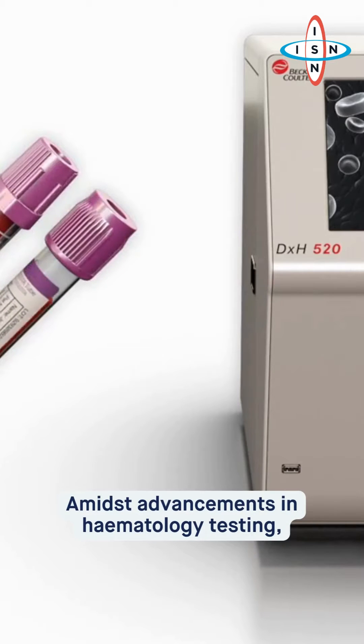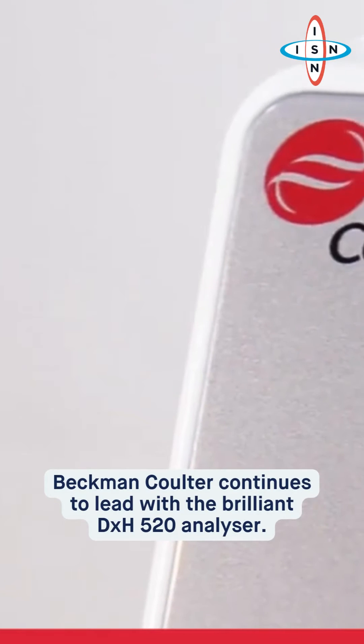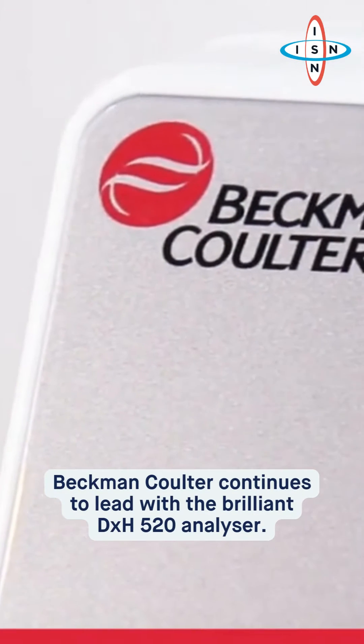Amidst advancements in hematology testing, Beckman Coulter continues to lead with the brilliant DXH-520 analyzer.